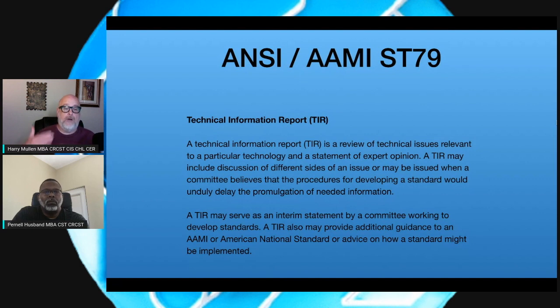So it's like, okay, they go ahead and release the information so that way we can get started. And then they release a report that gives the point of view from both sides as to how they came up with this, which is good because it ultimately goes back to the fact that it's a standard, and standards are not regulations.